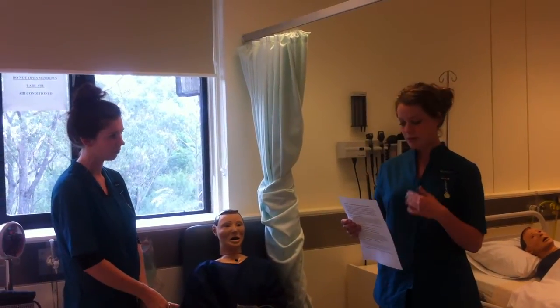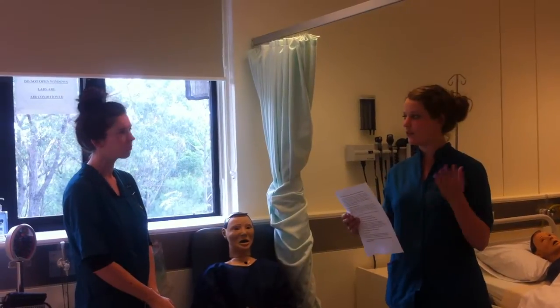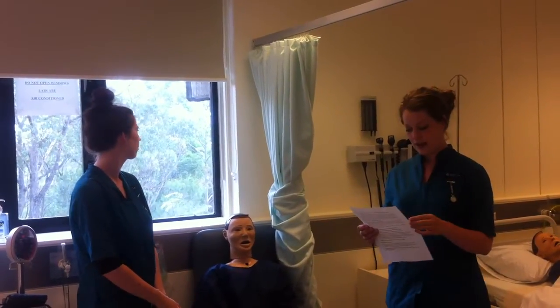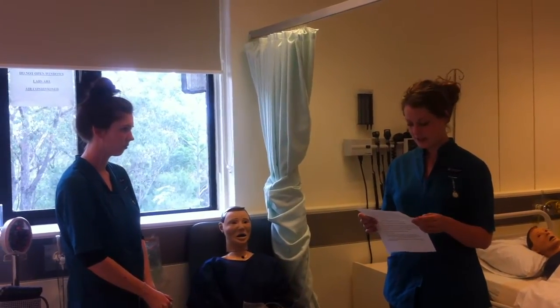So Penny will breathe with the patient and will slow her rate down to be a bit more effective, to relieve his anxiety levels and make the oxygen therapy a bit more efficient.